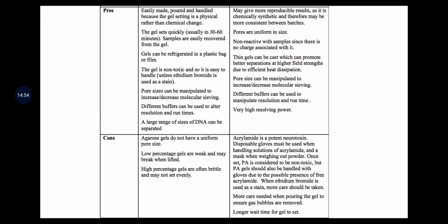The disadvantages or cons of agarose: agarose gels do not have a uniform pore size. Low percent gels are weak and may break when lifted. High concentration gels are often brittle and may not set evenly.